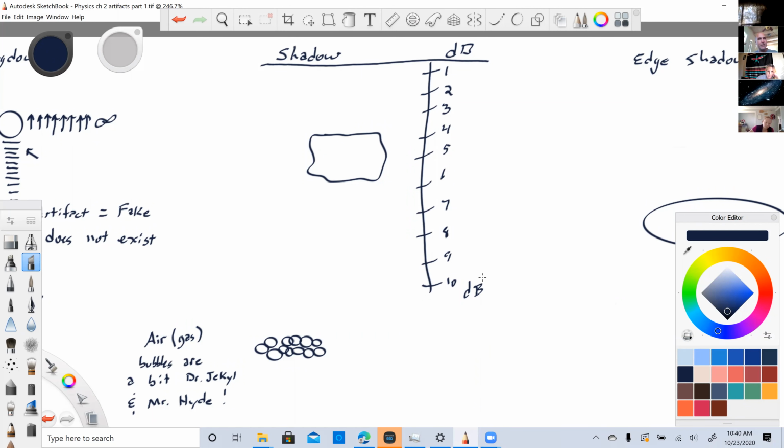And so it listens harder and harder, right? That's what our gain does. That's what our TGC does, actually, our time gain compensation. Every centimeter, every microsecond that goes by, the machine listens a little bit harder. It gains the signal a little bit more in order to create a smooth picture for us.